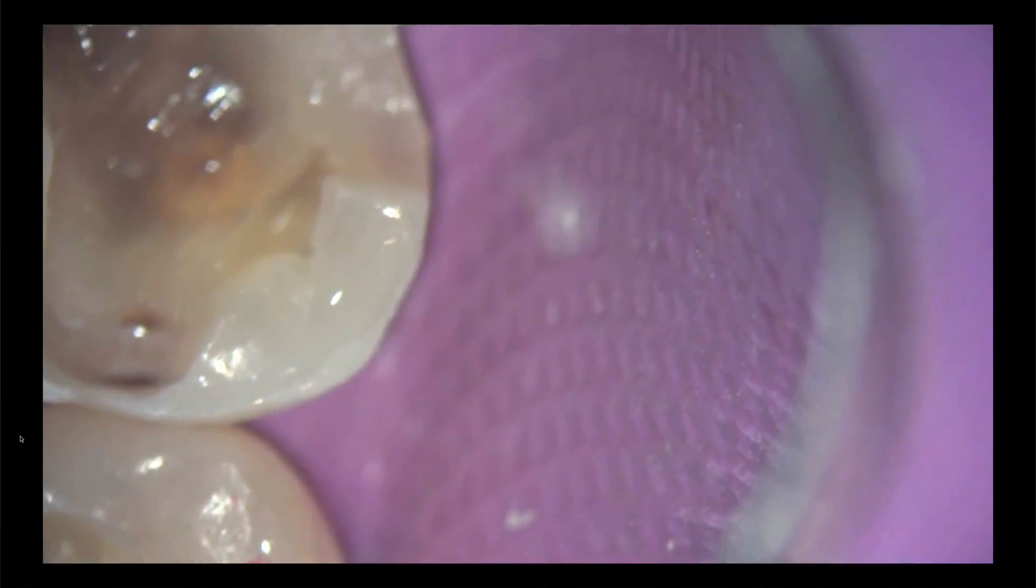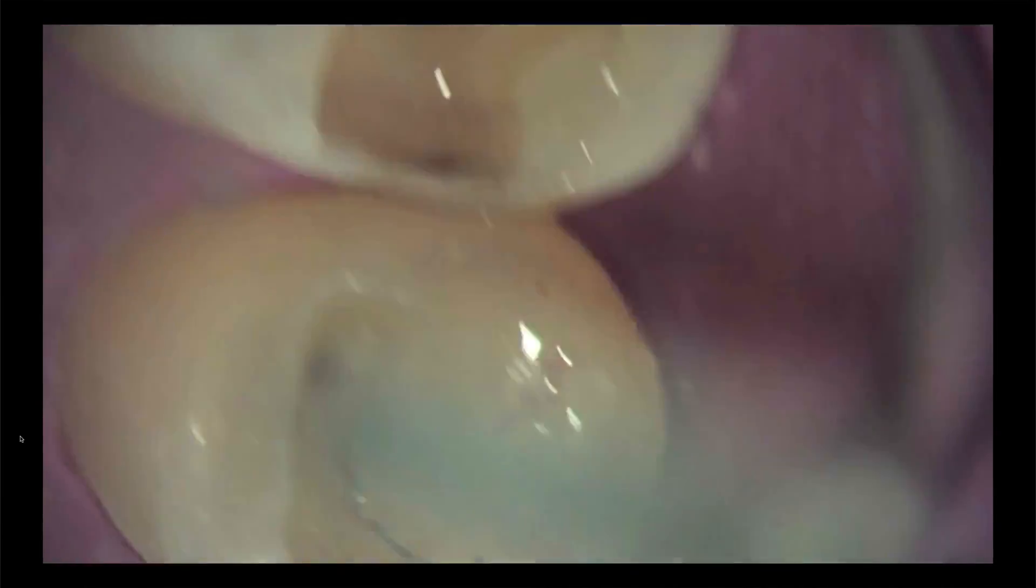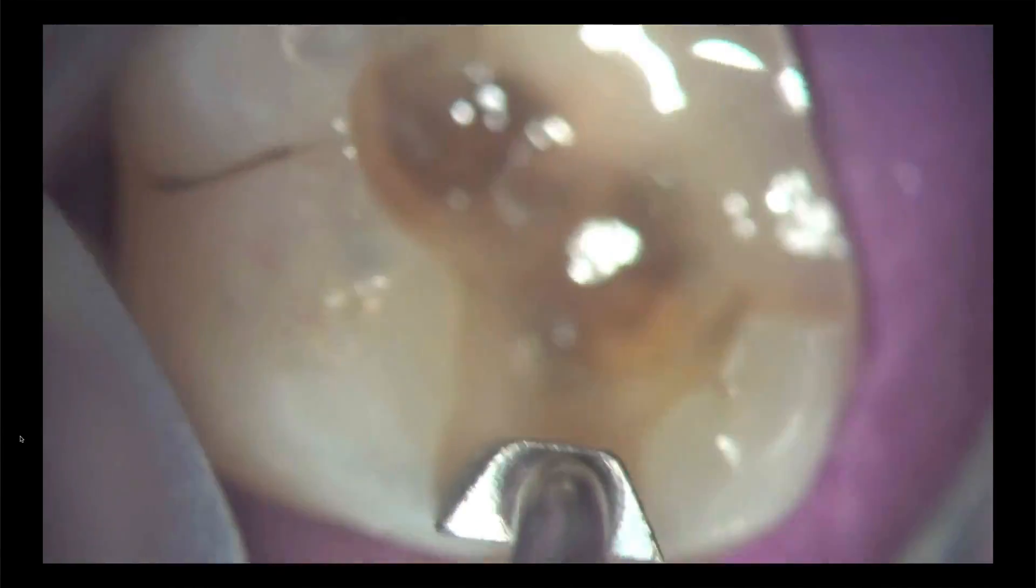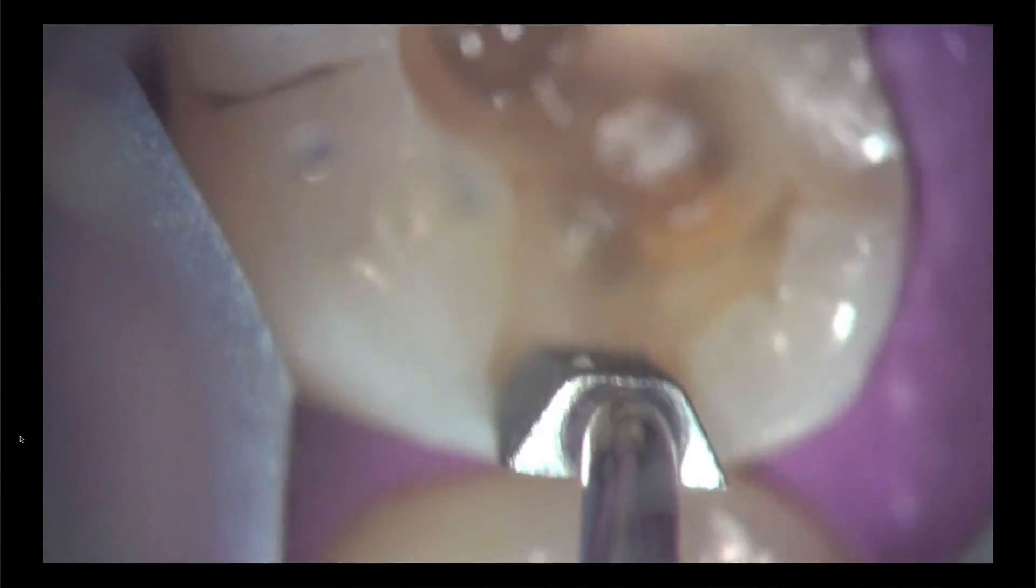So I'm now going to go in with a KS zero diamond and I'm going to just prep this a little bit again. It's not the best clinical video, but it's pretty darn good. It's hard to film upper posterior back molars in the microscope, but I think it's good enough that you get the idea. And as I said, I believe this is an important message. So you can see I'm leaving that shell of enamel and I'm just changing the box form a little bit. So the diamond sonic preparation tip can fit in there, but you see that that shell of enamel is there. And now I'm not going to go anywhere near the rotary instrument to the distal wall of the bicuspid. I'm going to go in with this sonic instrument. And now I just turn this on and this will just take that little shell of enamel out immediately. You can see it's gone already.